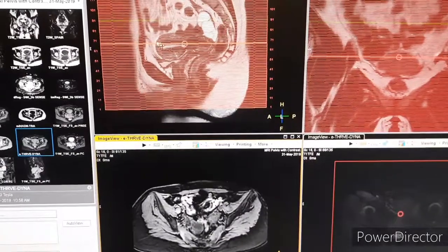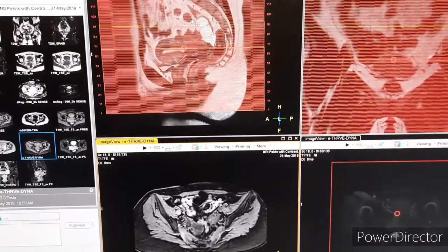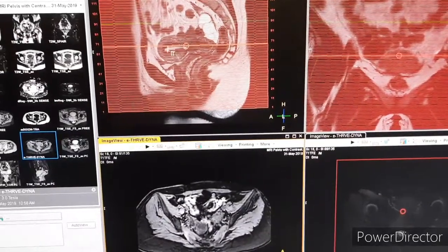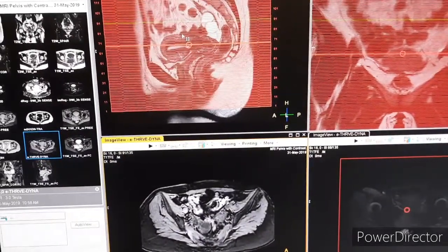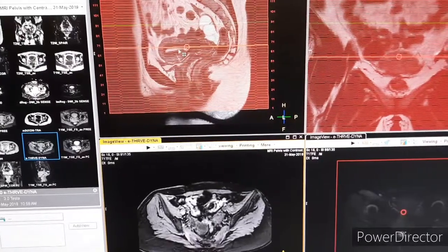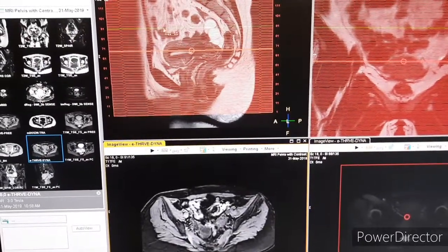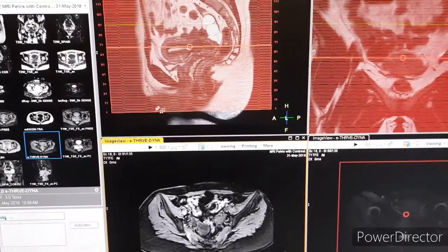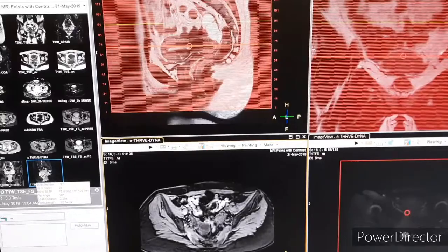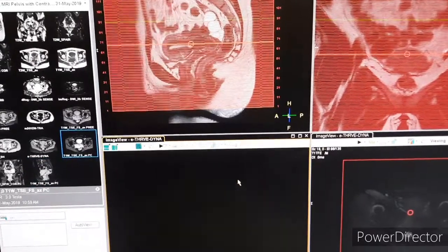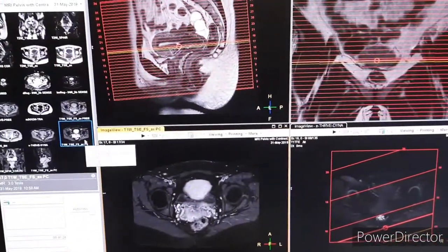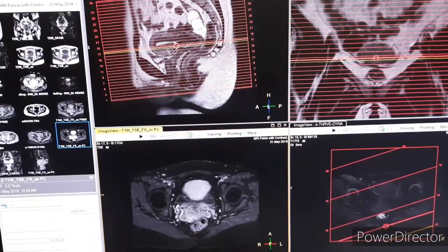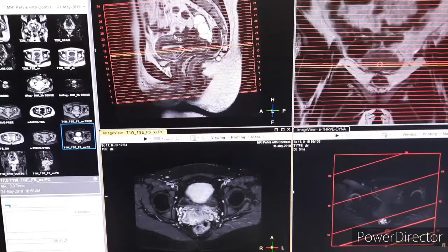You can see the planning of the dynamic and the area of coverage. In cases where the patient has a large fibroid or any other lesion, you can keep the planning line straight — as our region of interest is the lesion, not the endometrium. So in that case you keep it straight for coronal and axial planning.